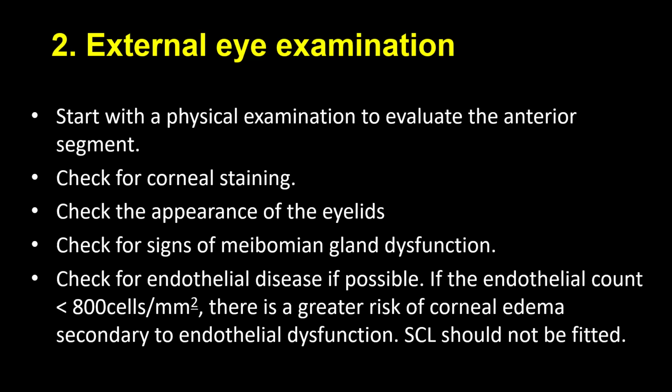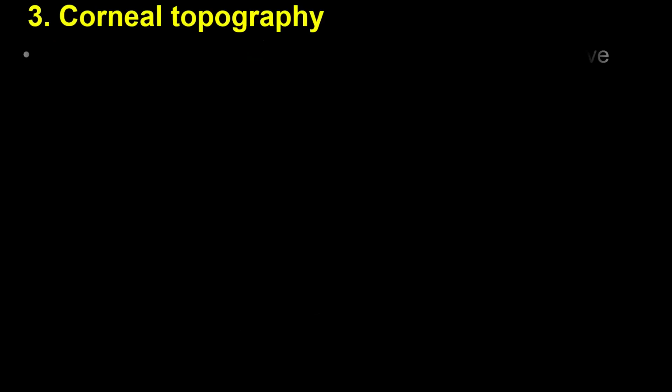Check for signs of meibomian gland dysfunction. That can also contraindicate the fitting. Check for endothelial disease if possible. You need to do that to check for risk of corneal edema. So that should be noted.